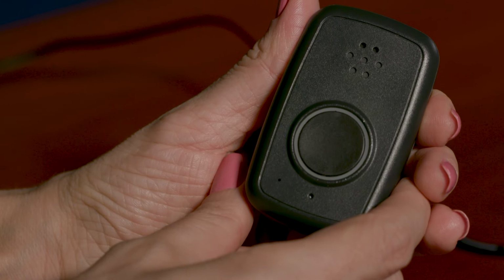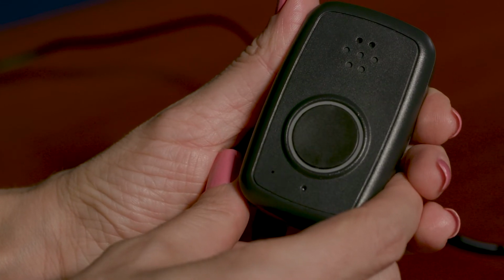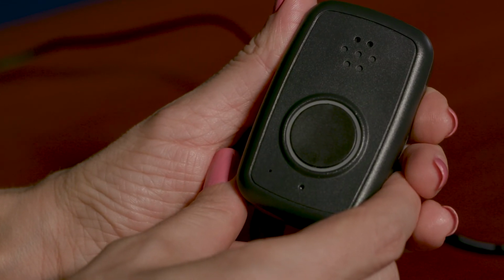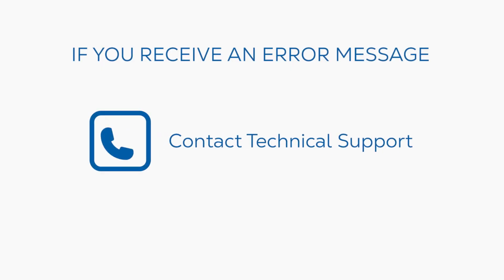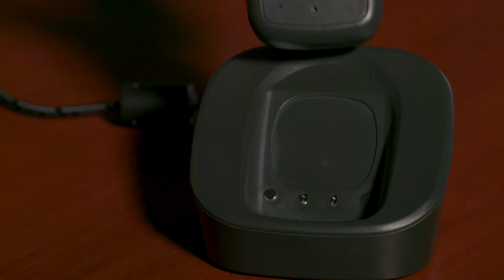However, if the micro says, "User auto test failed. Please contact customer support," you will need to contact customer support to further troubleshoot the device. Your micro is now ready to use.